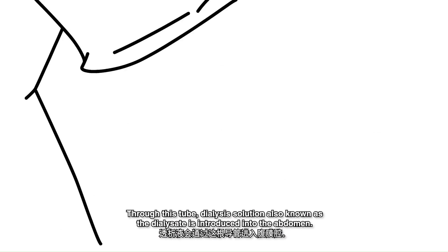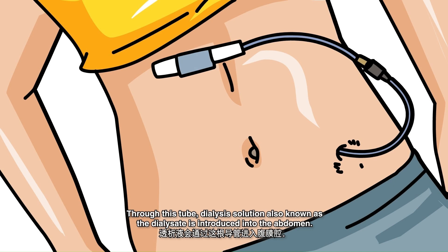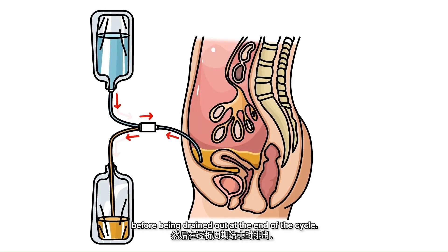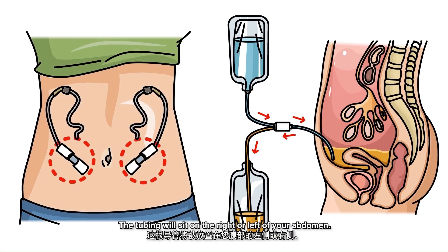Through this tube, dialysis solution also known as dialysate is introduced into the abdomen. The solution is circulated through the abdomen to remove toxins and extra water before being drained out at the end of the cycle. The tubing will sit on the right or left of your abdomen.